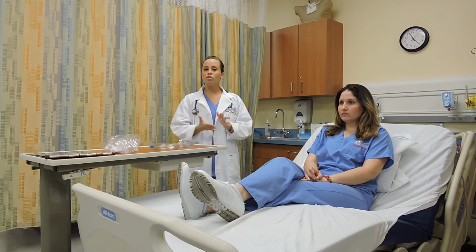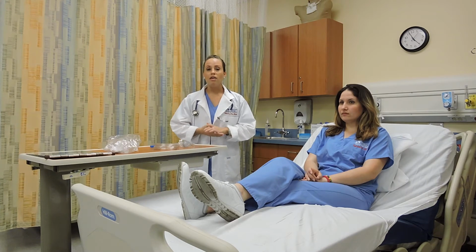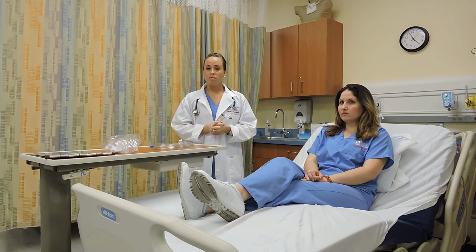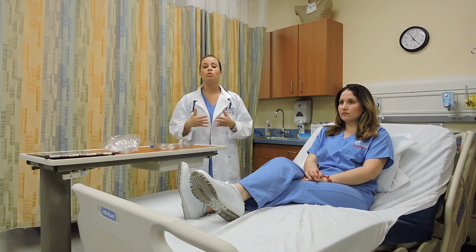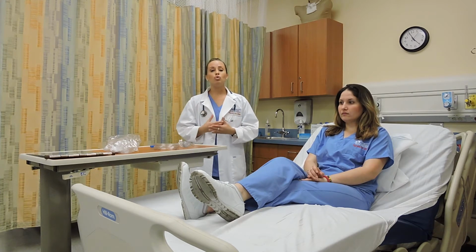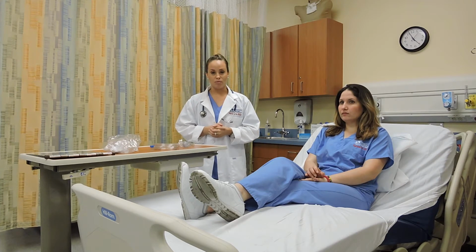As any other medical procedure, EzPap has its possible complications and hazards. These are the increased work of breathing, leading to hypoventilation and hypercarbia, increased intracranial pressure, cardiovascular compromise, and air swallowing, increasing the likelihood of vomiting and aspiration.